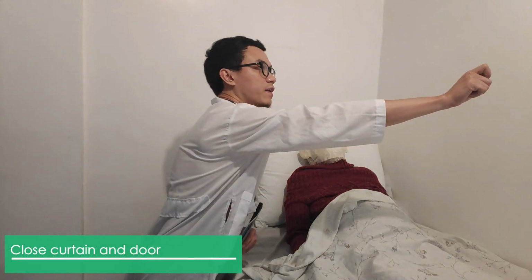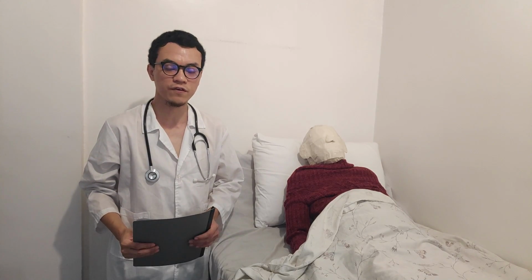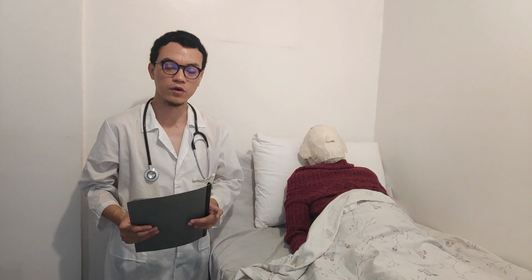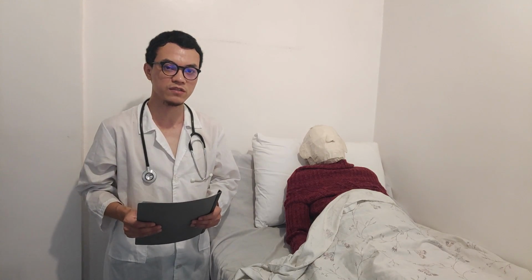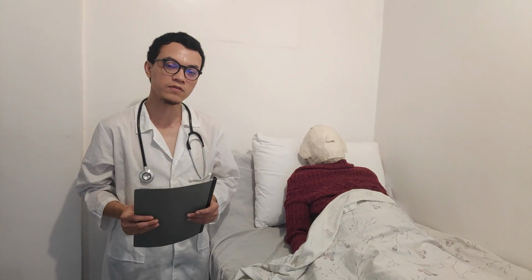After identifying the right patient, you can now close the curtain around the bed and close the door to the room to ensure patient's privacy. Next is explain the procedure and the reason for doing it to the patient, and then review safety precautionary measures when the oxygen is in use, and don't forget to place a non-smoking sign in the area as needed. Explanation will lessen the patient's anxiety and discomfort toward the procedure, and then placing a non-smoking sign will prevent possible accident.